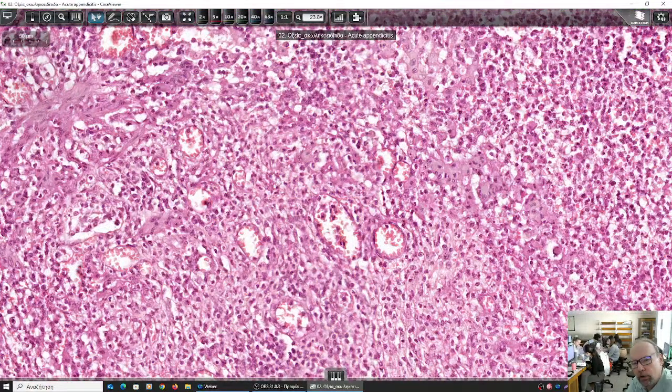These are the thin-walled vessels of the granulation tissue, which means that the inflammatory exudate is being organized. This is the granulation tissue. However, this granulation tissue has replaced the covering epithelium, the glandular epithelium of this part of the large bowel. When we have an inflammation destroying a covering epithelium and not being just an erosion, but we have granulation tissue formation underneath, we have pus filled with neutrophils, viable and non-viable, and it destroys the mucosal lining and replaces it with granulation tissue, like here.